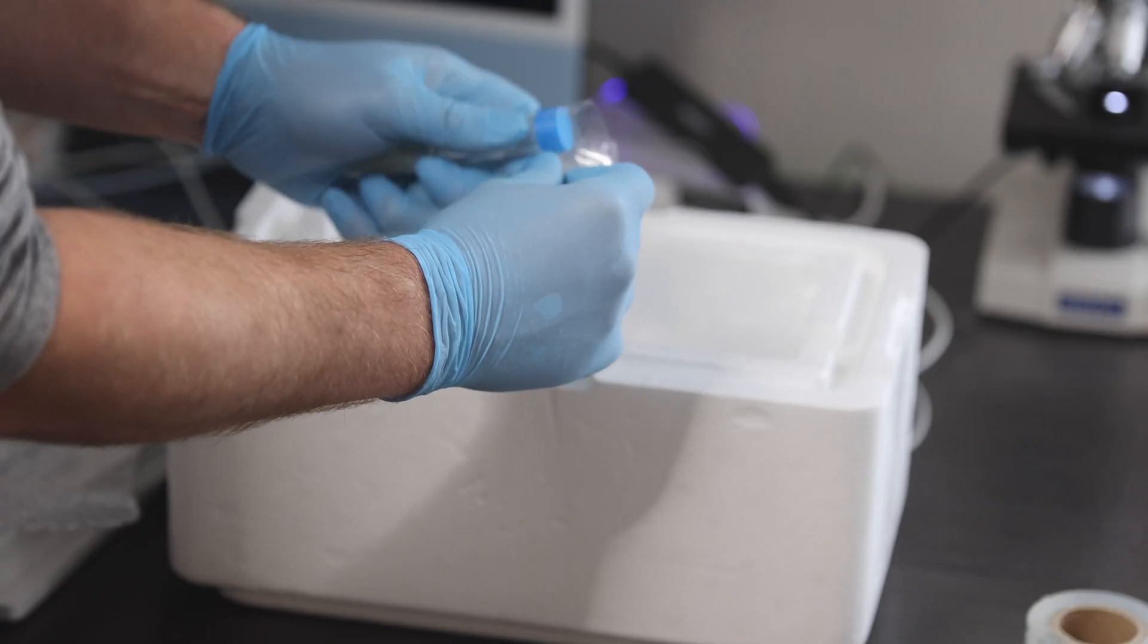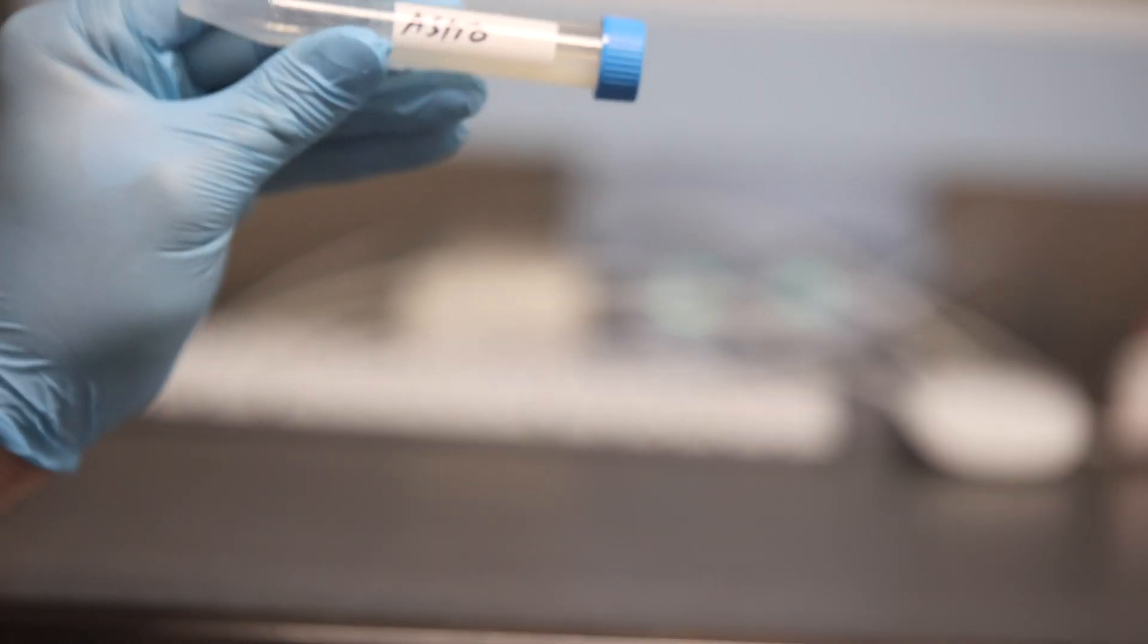Next, we'll put on the cap and secure it further with some tape and label it so it doesn't get confused with another sample at the vet lab down the road.